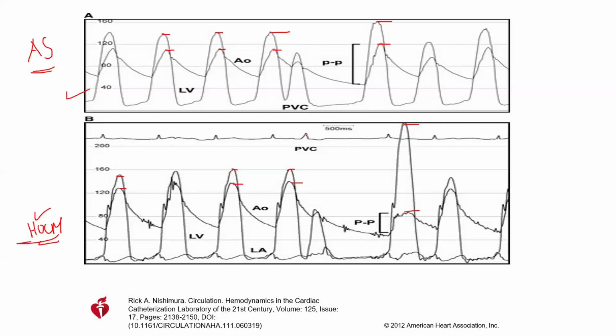The pressure difference across the aortic stenosis, and the gradient is more increased. So, look at the pulse pressure. What happens to it? It widens compared to the baseline. Now look at the pulse pressure here. It shortens compared to the baseline.